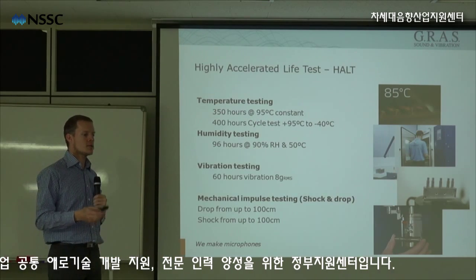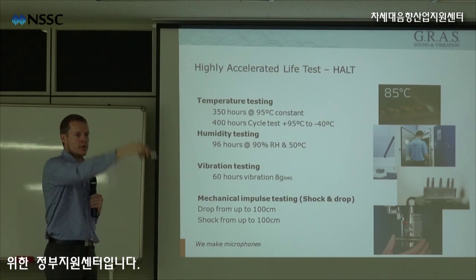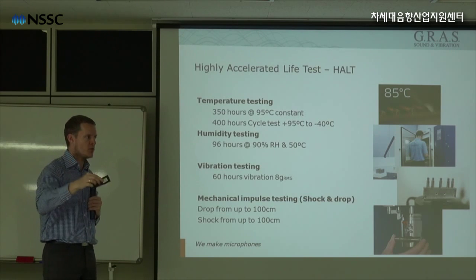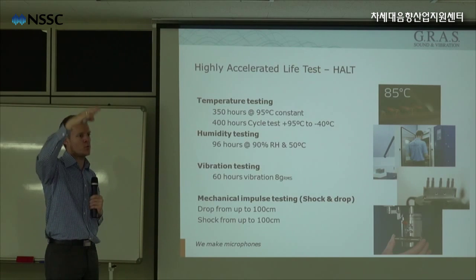And these tests are tests where we have the microphone placed first this way, and we have a test directly on the protection grid. And the drop test is a random drop test where we drop the microphones and we calibrate it afterwards to see what is the impact. And then we increase the height. So we start with 10 centimeters and go up to 1 meter.